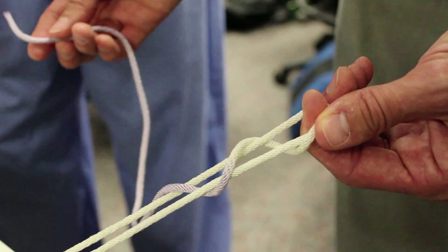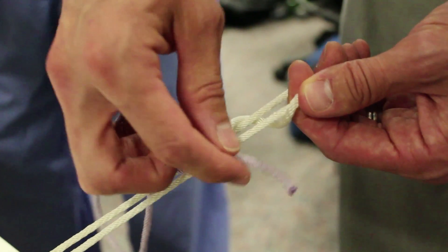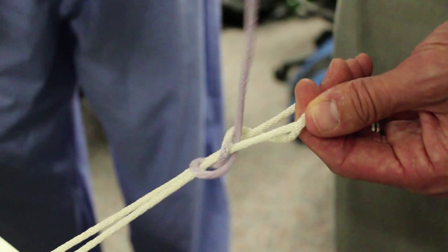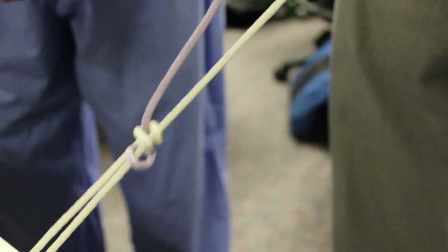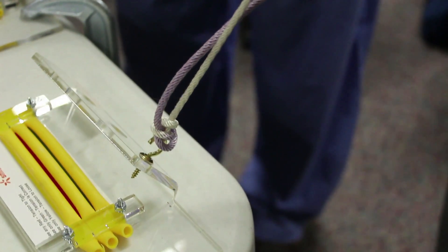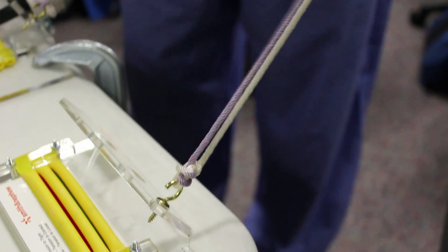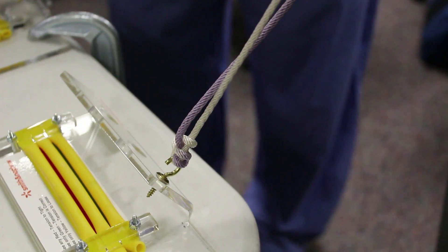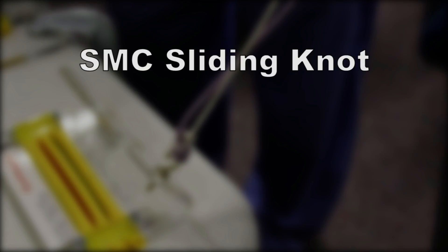Through this one here? Yep. Up through it. Up through it. Yeah. Okay. And then slide. And then you have to lock your knot. You just need to lock it once it's all the way down. Okay. Yeah, alright. Okay. End of time.